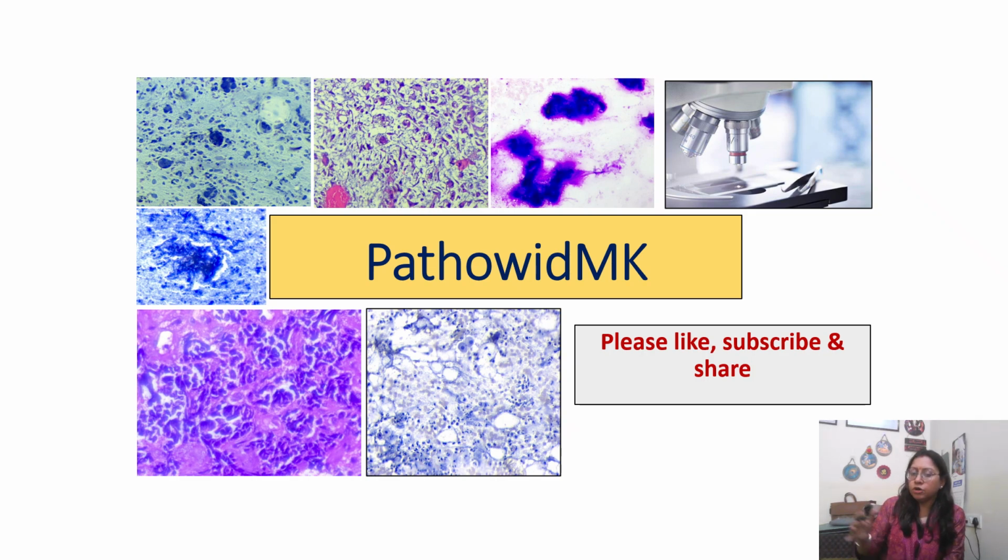If this rule of 3 is not followed, go for checking your pre-analytical errors and machine errors, and then retest. If all those things are correct, go for retesting. Even if the retesting does not give you a concordant rule of 3 result, then you need to go for further investigation, like making a peripheral smear to confirm whether the patient is having any pathological condition or not, like iron deficiency anemia or hereditary spherocytosis.